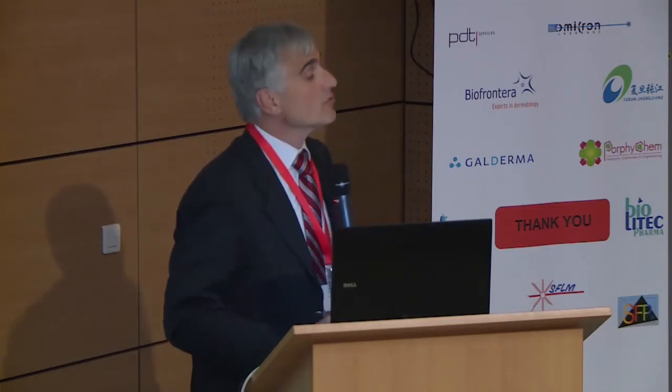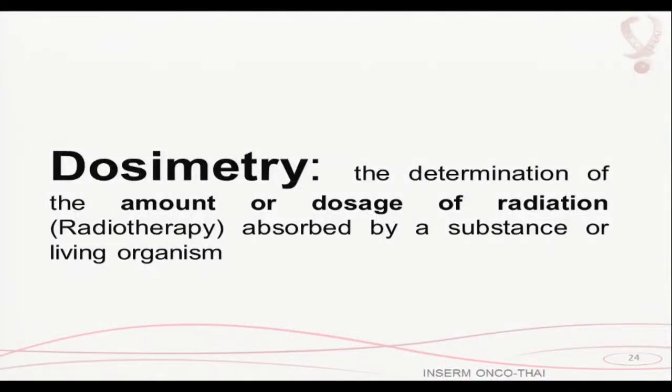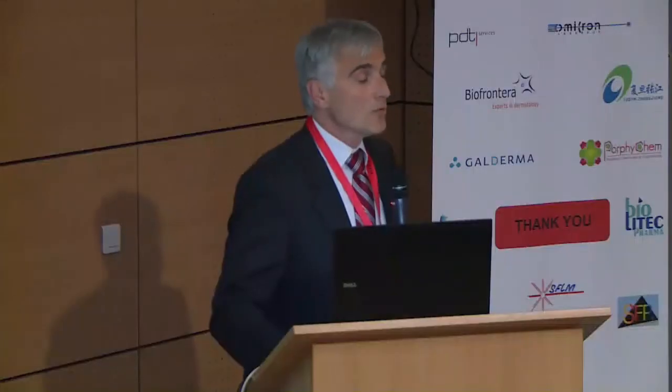So now let's move to dosimetry. Again, dosimetry is the determination of the amount or dosage of radiation absorbed by a substance or a living organism. And I think we should really follow and use what is used already by the radiation oncologists. If you want to promote PDT, we should use the same words, we should use the same approach. Otherwise, we are in trouble.